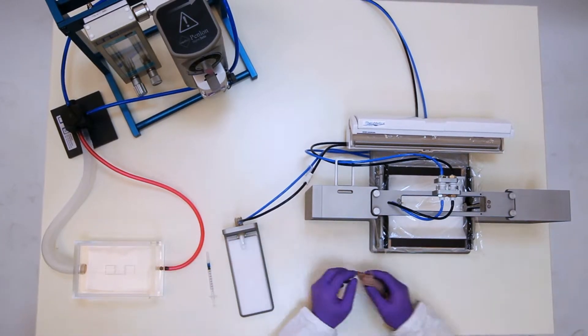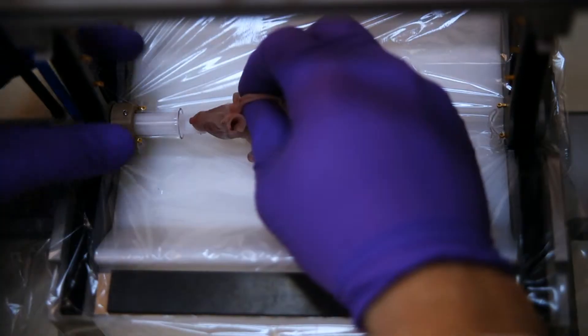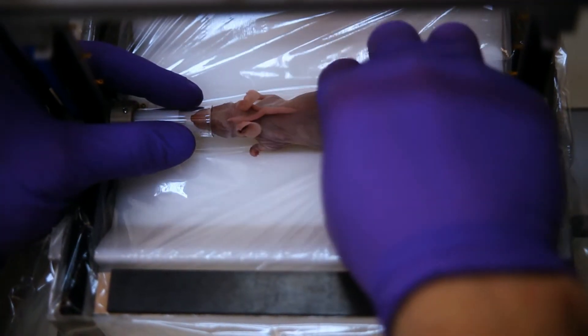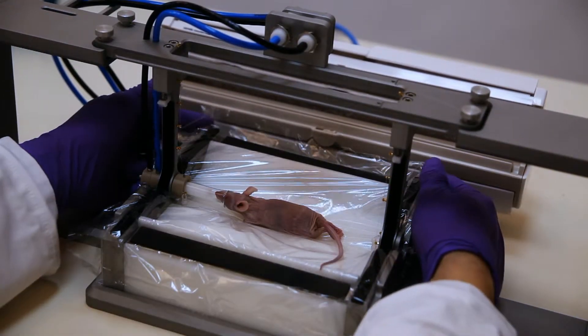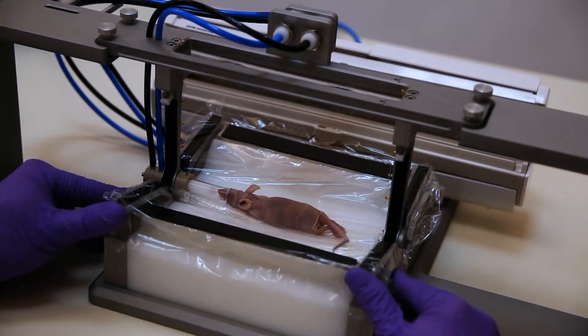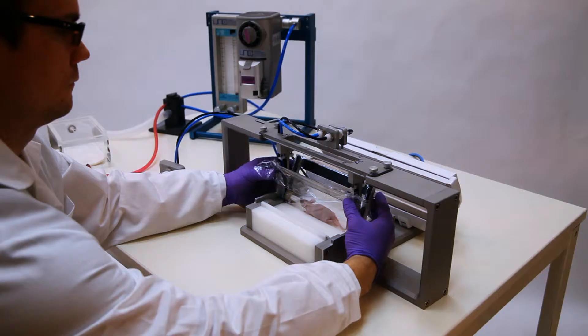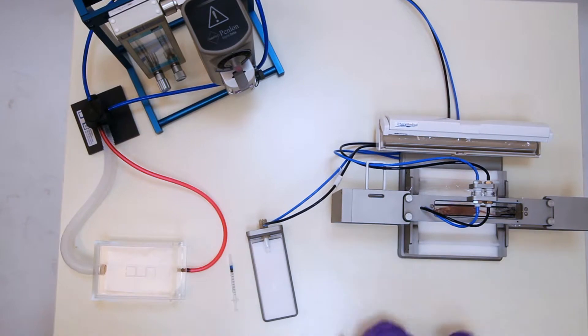The animal is placed onto the membrane in the animal holder. It is held in position via a tooth bar. A nose cone ensures safe anesthesia delivery. Clamps are folded up to surround the animal with the coupling membrane.